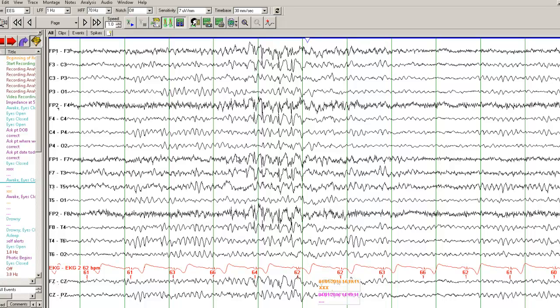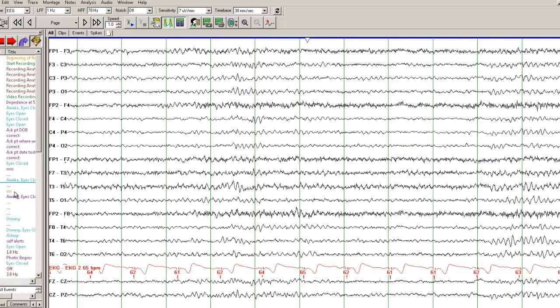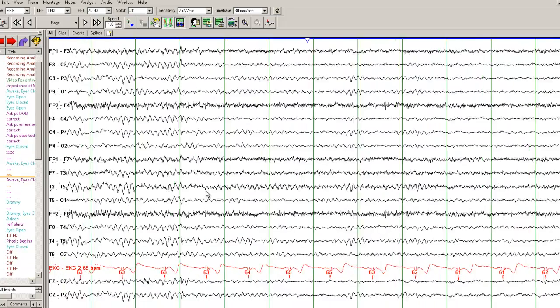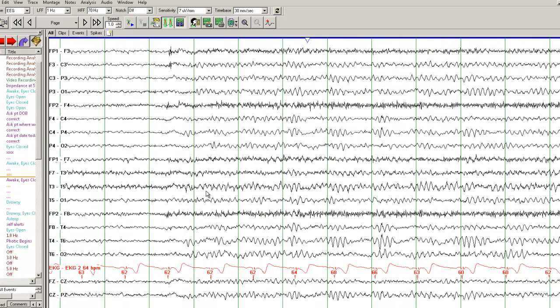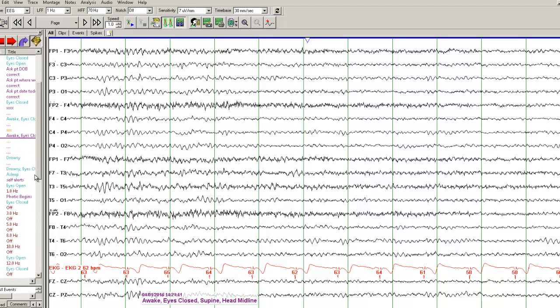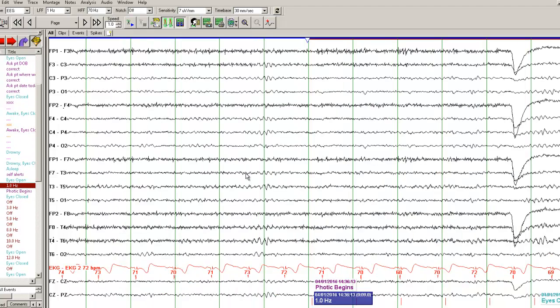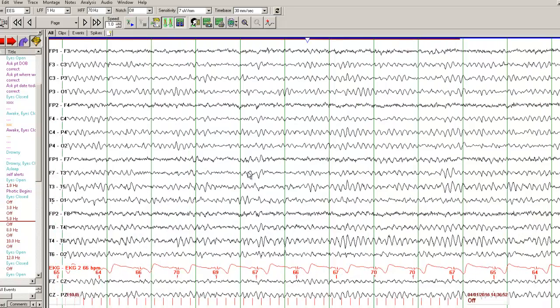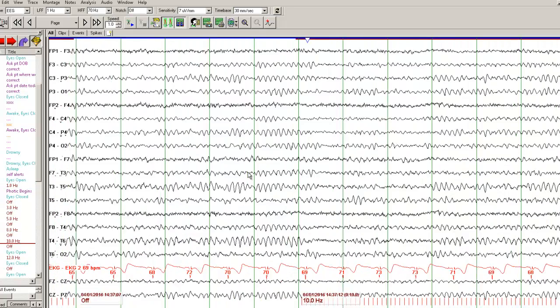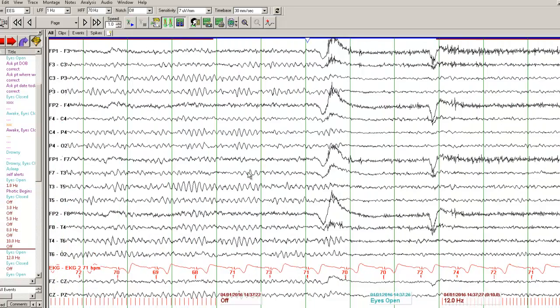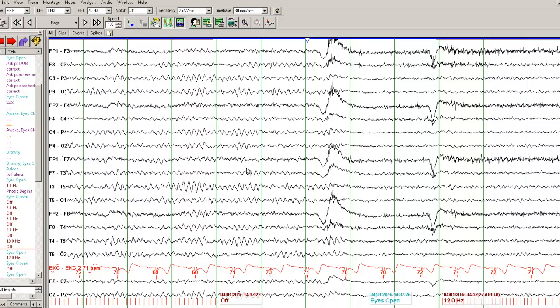Let's keep moving on. So when this person was having the spike in wave discharges, we looked at the photic stimulation. There was not a whole lot change with this photic stimulation. You have to remember that approximately 15% of patients with generalized epilepsy are photosensitive, meaning you may see spike in wave when you expose them to strobe lights. As compared to 2% of patients with focal epilepsies, they are also photosensitive.